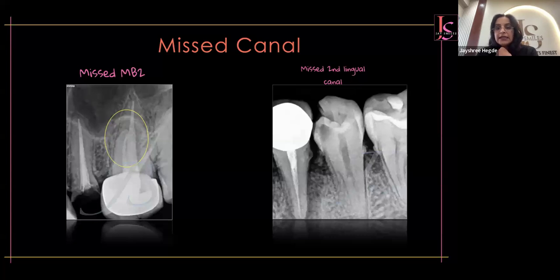And the second image is your lower premolar, that is 3-4. And again, you see that the dentist who did the obturation for this, it's not bad at all. You can see that the GP has gone all the way to the root.